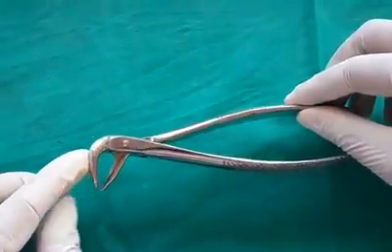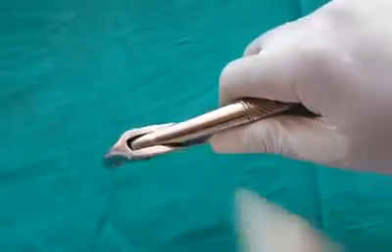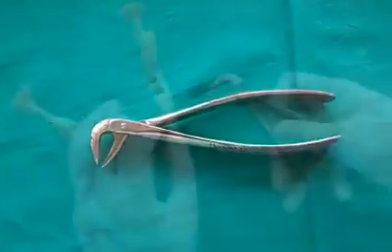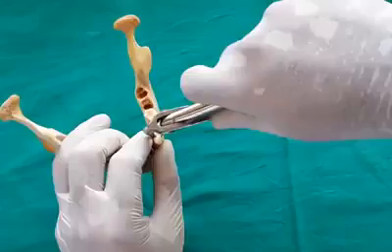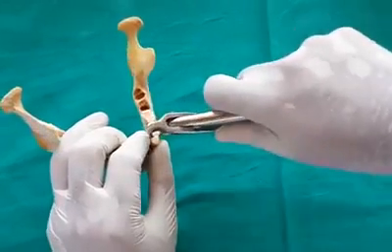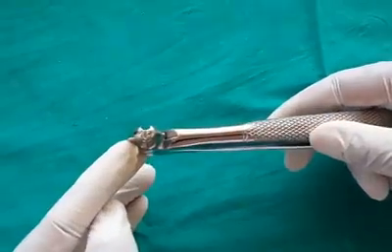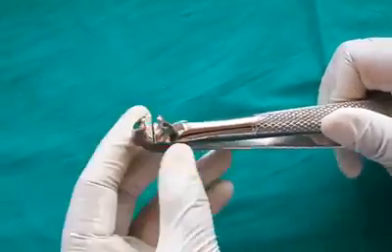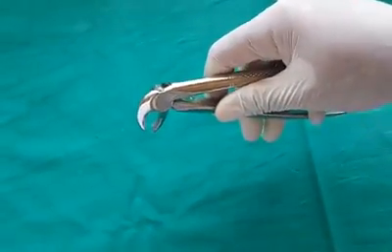Mandibular premolar forceps are used for extraction of mandibular premolars. They are much similar to anterior forceps, but the beaks do not come in contact. Mandibular molar forceps are used for extraction of mandibular molars; both beaks have a sharp projection which engages the furcation area. Unlike the maxillary counterpart, this is a single instrument which can be used for both sides.